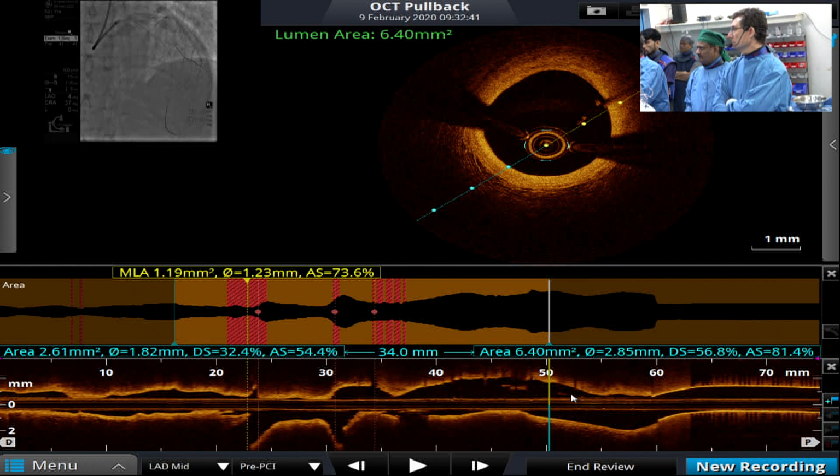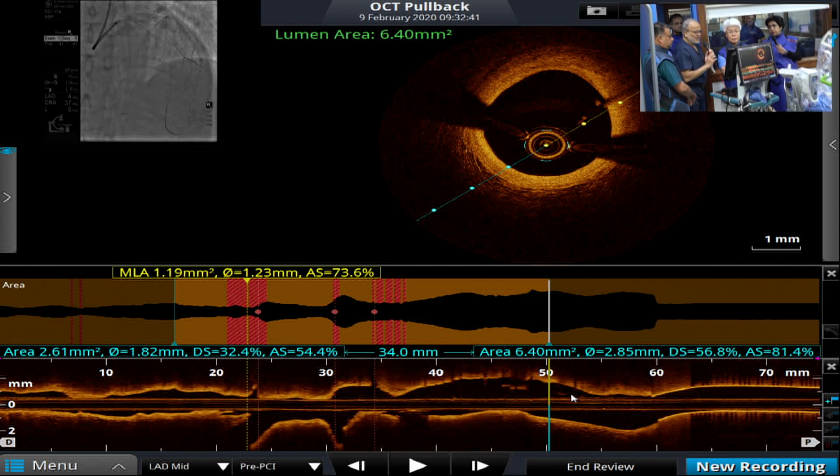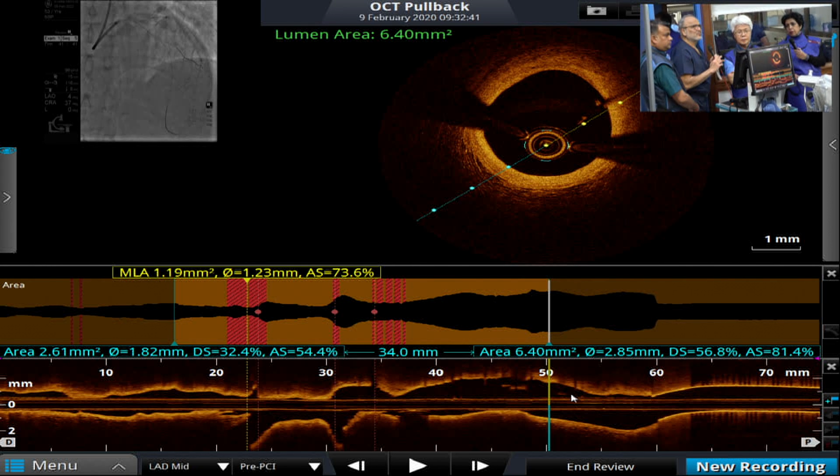That's fine. So what length do you want? 2.0 will go up to 3.0. It can go up to 3.25. That's wonderful. I see. Because it is Onyx, yeah.